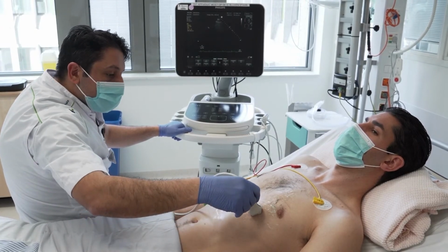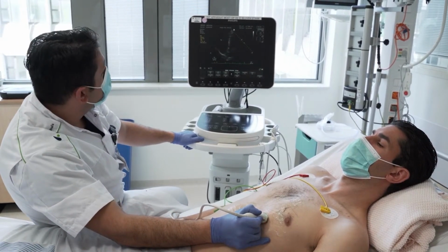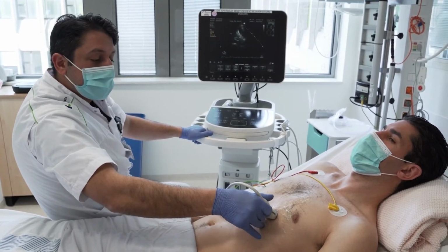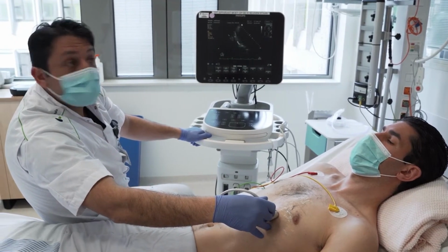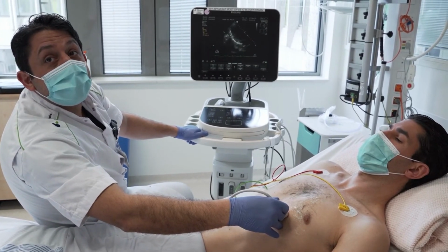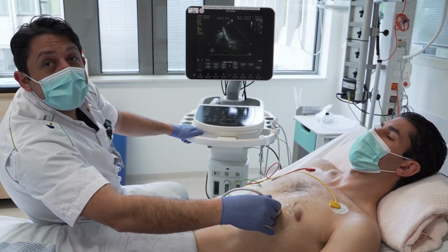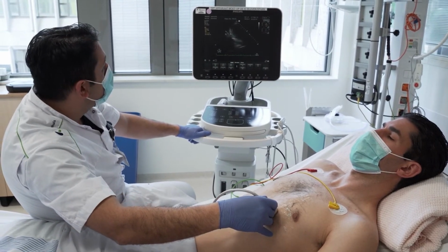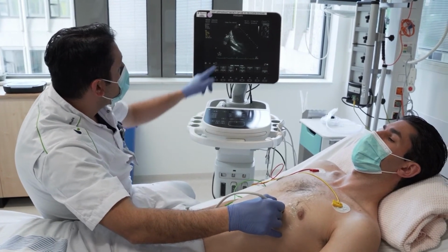Is there any more we should say about this window, Sakir? No, it's enough, 4-chamber view and 5-chamber view, and we can just go through by turning left 90 degrees for the 2-chamber view for further assessment of the wall motions. In case of acute coronary syndrome or post-cardiotomy ischemia on your EKG, you can check the wall motions by these windows. Okay, that concludes our cardiac windows.